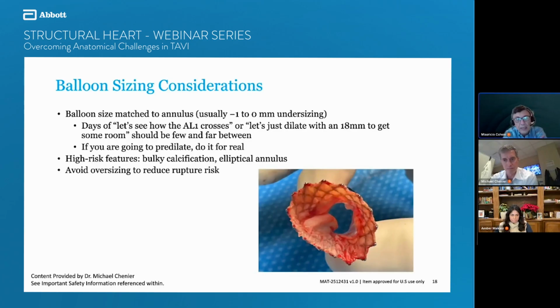I think a very aggressive pre-dilation with a non-compliant balloon helps. I think it prevents you from having to post-dilate. I'm always sweating bullets when I post-dilate, because if the valve is a little bit high and then there's a loss of capture, the balloon pops out together with the valve, and then you have a different situation to deal with.